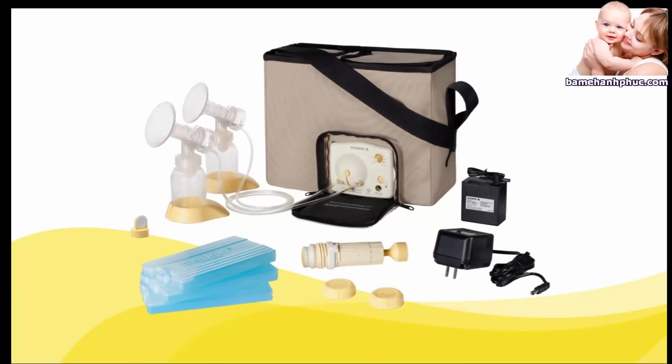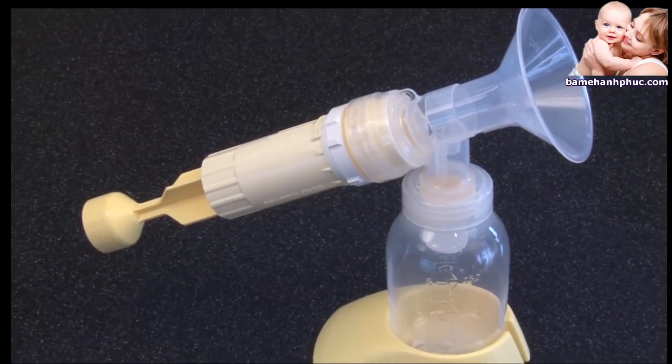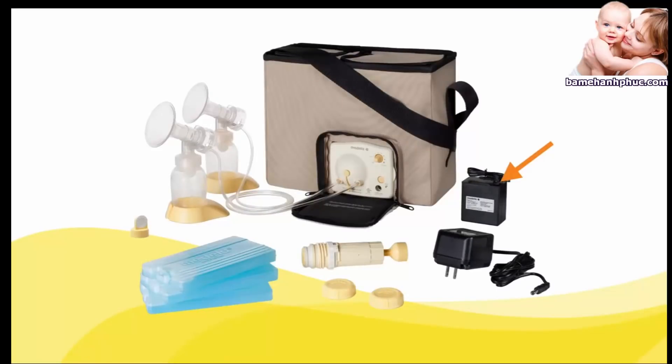The pump includes four bottles with lids, two bottle stands, two valves, two membranes, two sets of Personal Fit breast shields, two breast shield connectors, tubing, a power adapter, three ice packs, and a manual pump. To assemble and use the manual pump, see the instructions that came with your pump for details. A battery pack is available in some models.